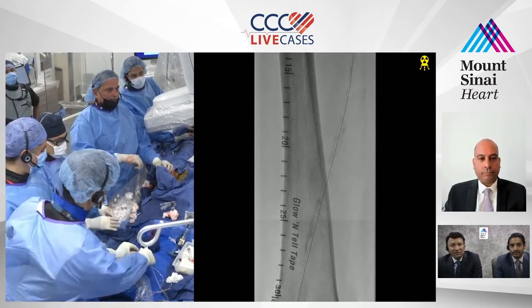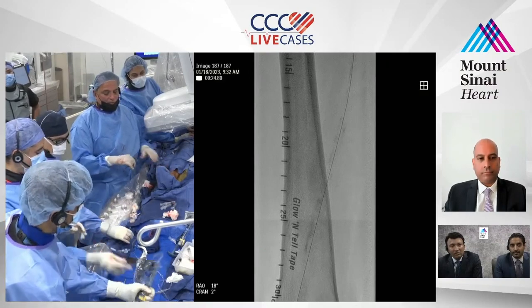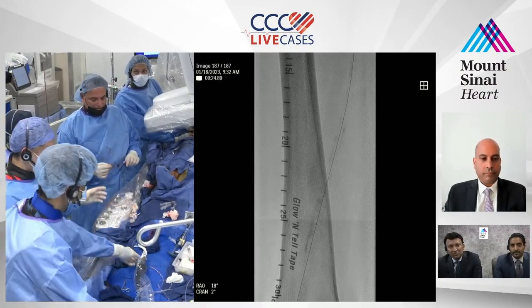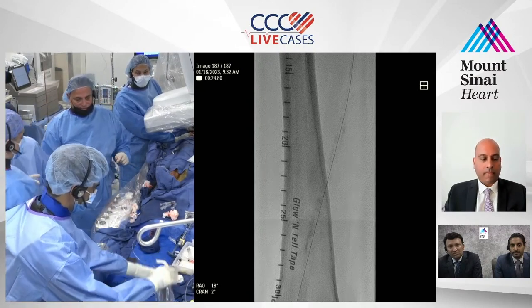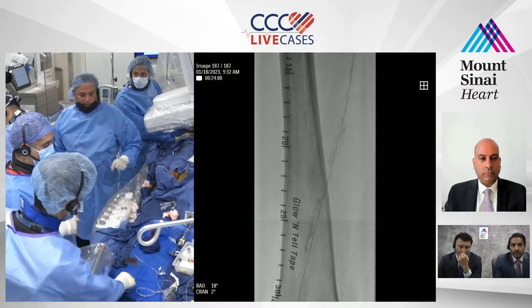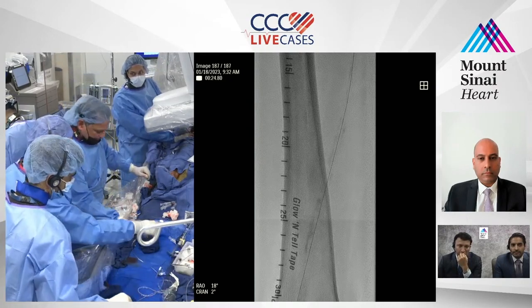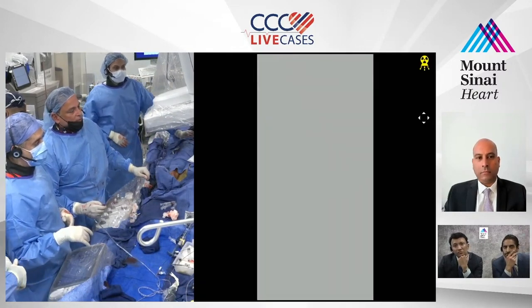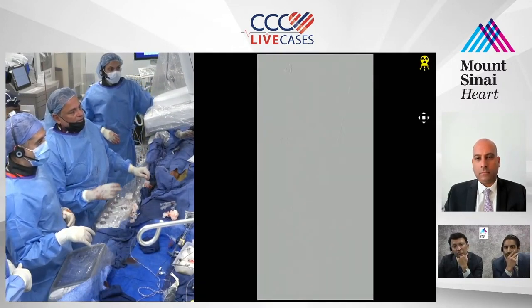Okay, so now give me a 018 Navicross. No, a 035 Navicross, actually. Yeah, it'll be easier. So now let's take a DSA while we're here, guys. Let me see. Careful. The worry here is rupture, as we all talked about.